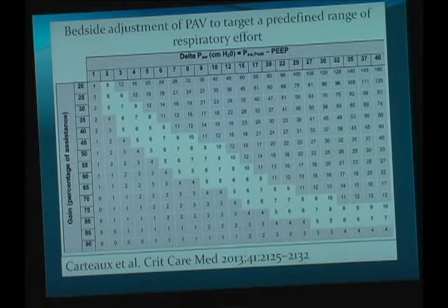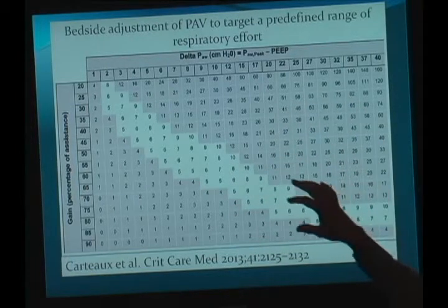So you have to think about what is the amount, and you also can go to the other part to ask the patient, are you comfortable enough or not? So this is another approach that the people working in France decide: that we don't rely on the sophisticated calculation of the machine, but you can go backwards to calculate what is the pressure that the patient develops in every breath.